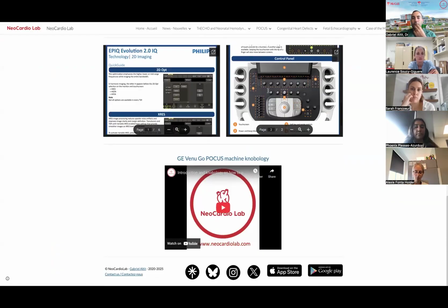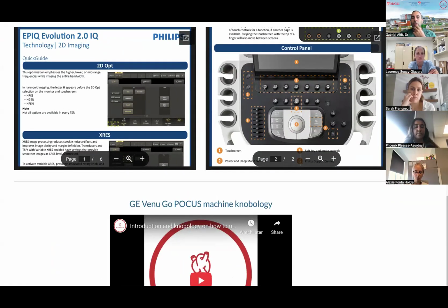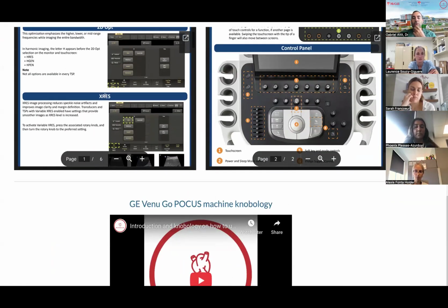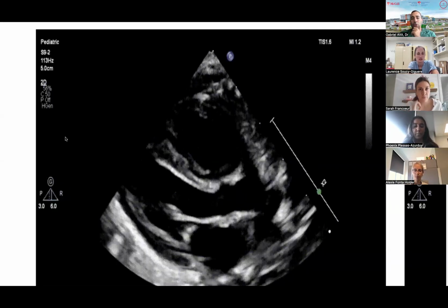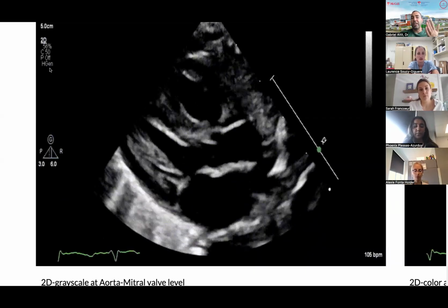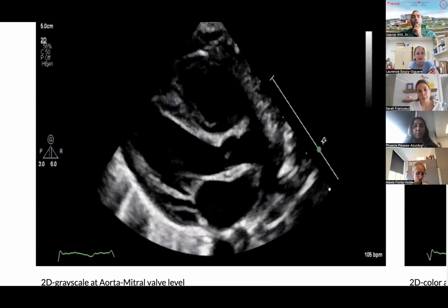Let's go back to the keyboard. This wheel will often correspond to what you see as "gen", so you'll be able to change between general, resolution, or penetration. These three options activate different ranges of ultrasound frequencies, in megahertz, for your actual imaging. So for this particular patient, a general frequency was used.